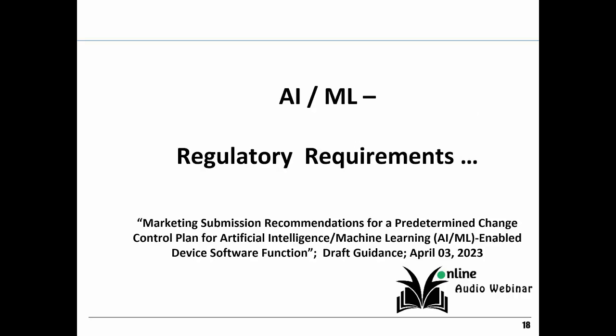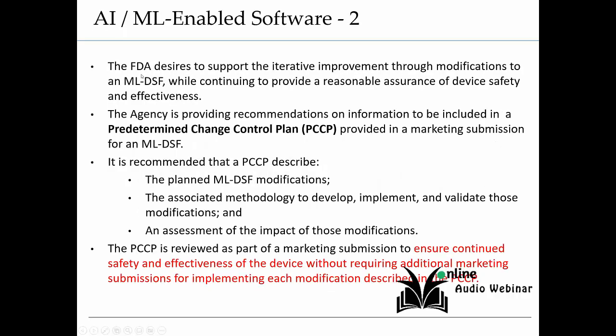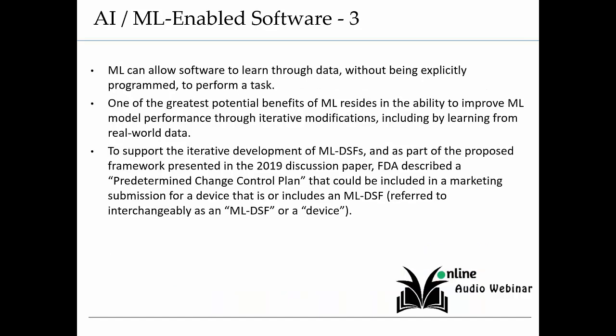Okay, let's look at the regulatory requirements. The focus of this framework is under this heading, Marketing Submission Recommendations for a Predetermined Change Control Plan. That's the PCCP. Now here, Machine Learning Enabled Device Software Functions, or ML-DSFs. You're going to see that throughout here. FDA desires to support the iterative improvement through modifications, using these considerations. Machine learning obviously allows software to learn through data without being programmed, in other words, without human intervention to perform a task.